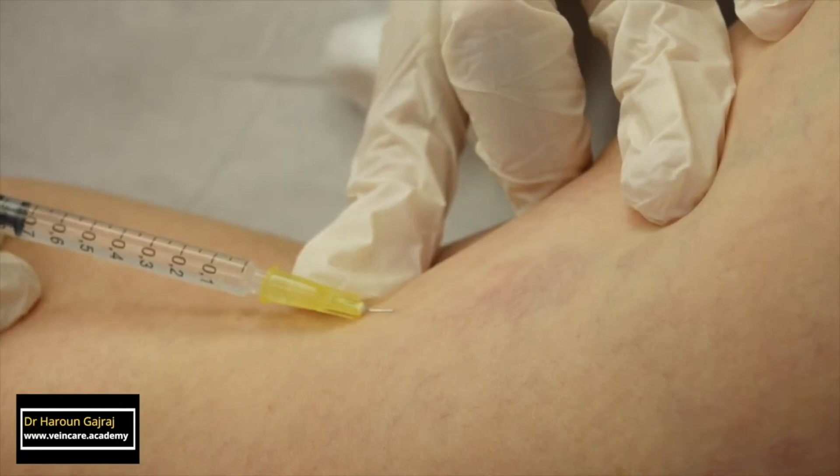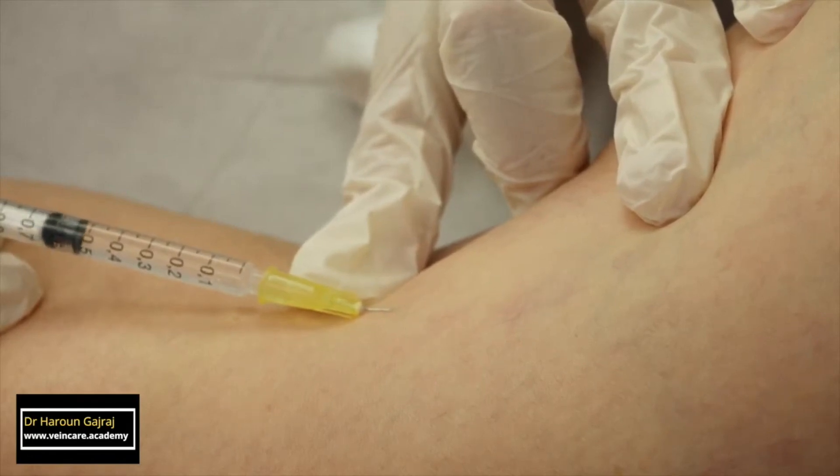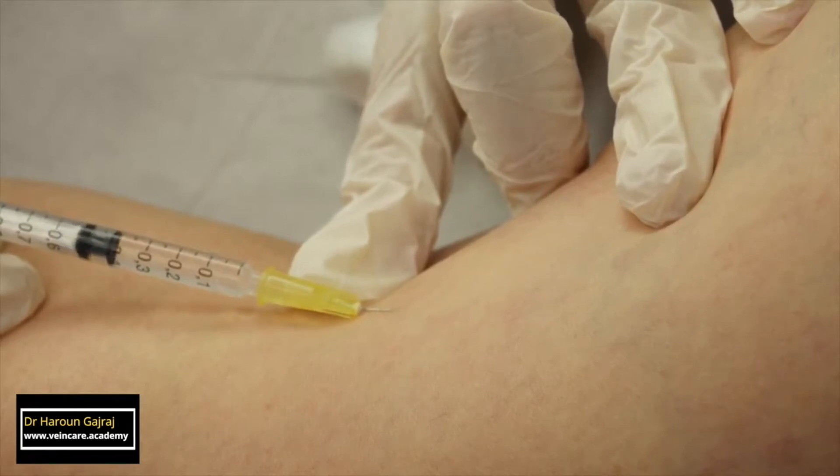Blue reticular veins, in association with the telangiectasias, are treated first. The sclerosant is injected slowly, up to a maximum of about 0.5ml for any single injection site.